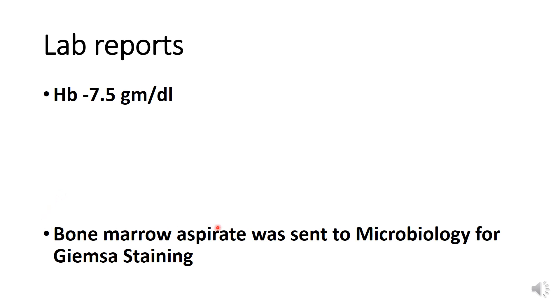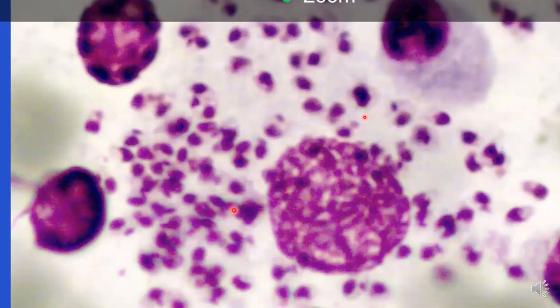So, bone marrow aspirate was sent to the Microbiology for Giemsa staining. On Giemsa staining in Microbiology Department, the picture was like this. These are amastigote forms of Leishmania parasite along with mononuclear cells, large mononuclear cells.